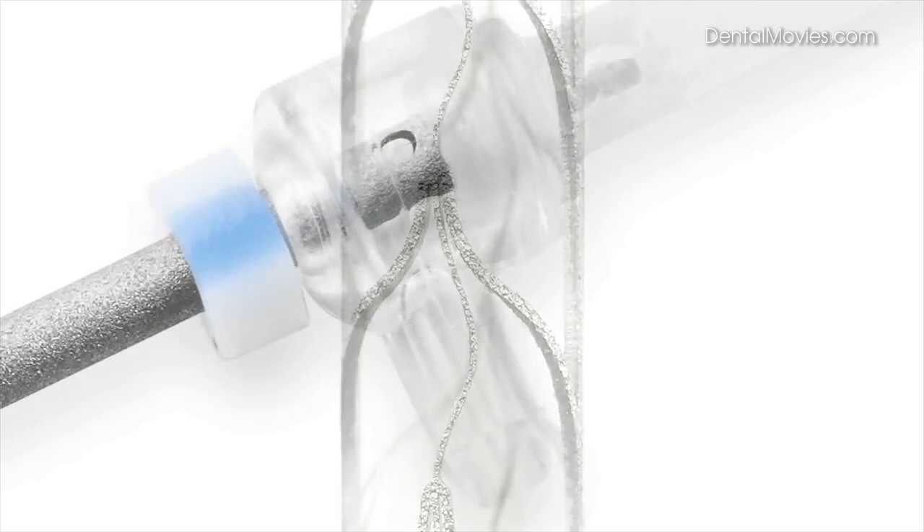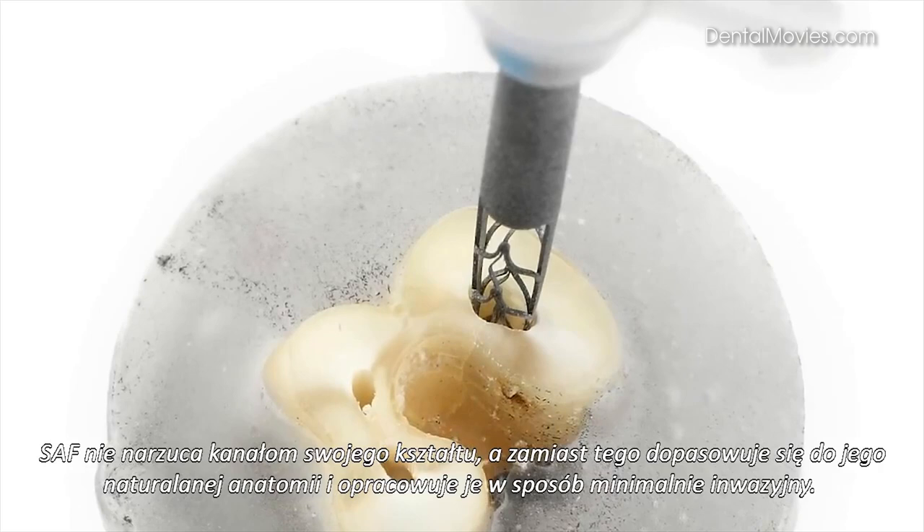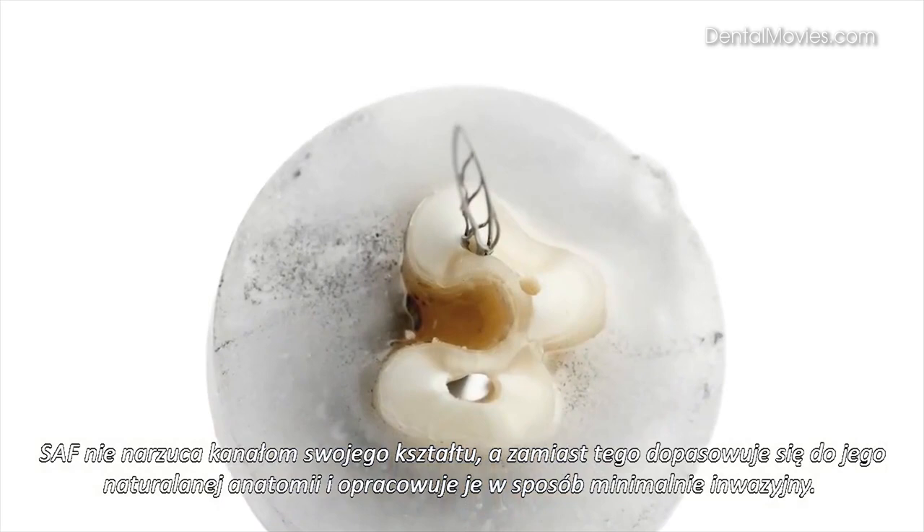An irrigation bar built into the hollow shank enables a dentist to irrigate simultaneously during shaping, facilitating superior cleaning and disinfection. The file does not impose its shape on the canal; instead, it will custom fit itself to any root canal anatomy and shape it in a minimally invasive way, removing more contaminated dentin while conserving healthy tooth structure.